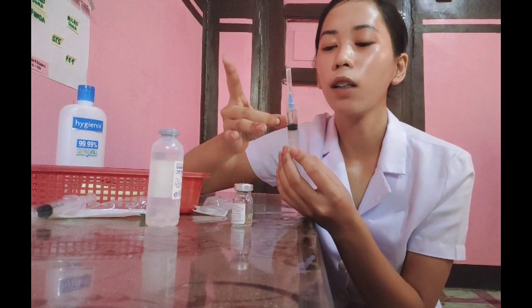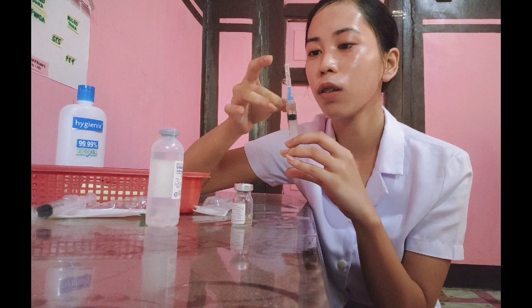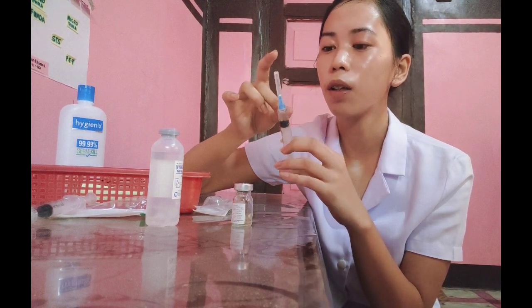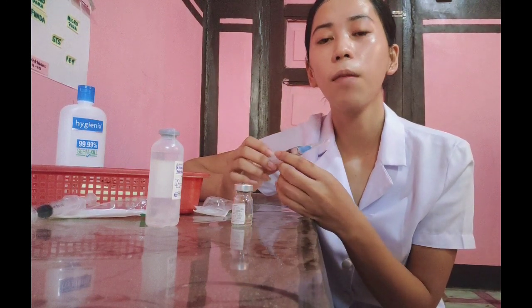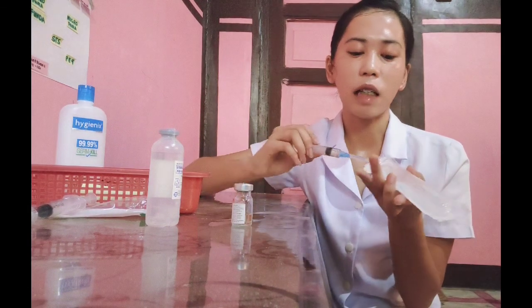And then, if necessary, tap the syringe barrel to dislodge any air bubbles present in the syringe. The rationale is the tapping motion will cause the air bubbles to rise to the top of the syringe where they can be injected out of the syringe.